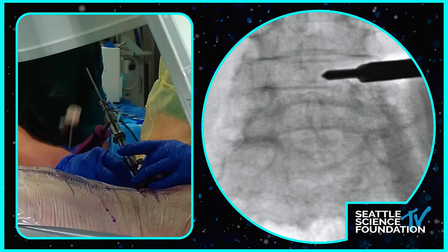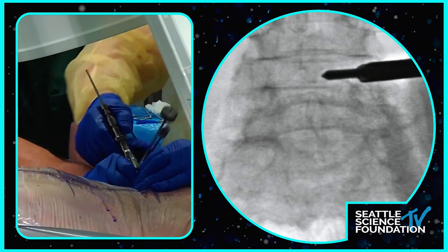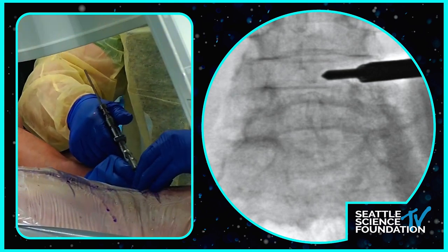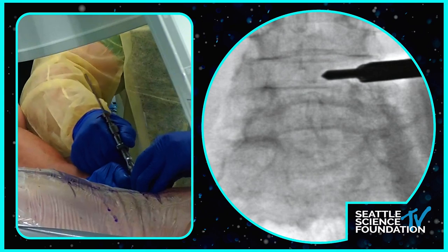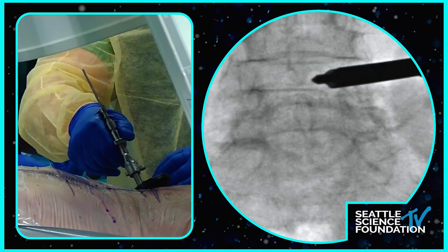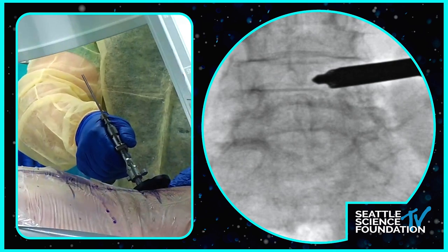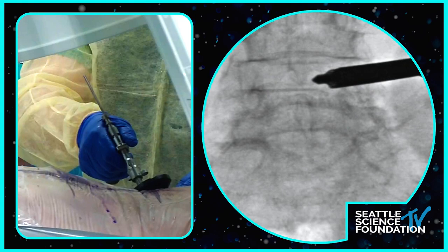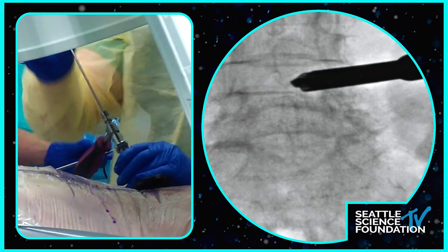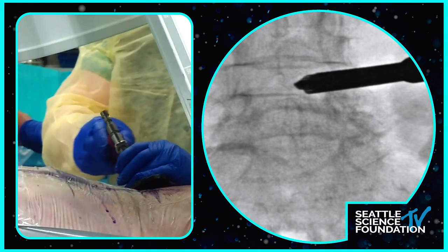Ray, you want to talk a little bit about the implant, its footprint and expandable capabilities? So this is the shot there. It's a mesh bag. Mm-hmm. You put allograft bone in it, and it expands and fills the space that's available. Right now, there's not a lot of space available because we didn't get a complete disc.